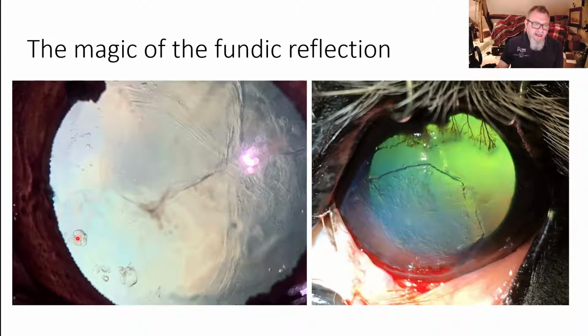This patient here has got multiple changes in the lens. We can see these individual linear lesions are individual lens fibres within the anterior lens, which are becoming abnormal. We can see some posterior lens changes as well, and we can see these beautiful bubbles which are in the equator of the lens. We're looking obliquely across this dilated pupil, and all these bubbles are individual lens fibres which are really struggling to change, as they should grow into long linear lens fibres.